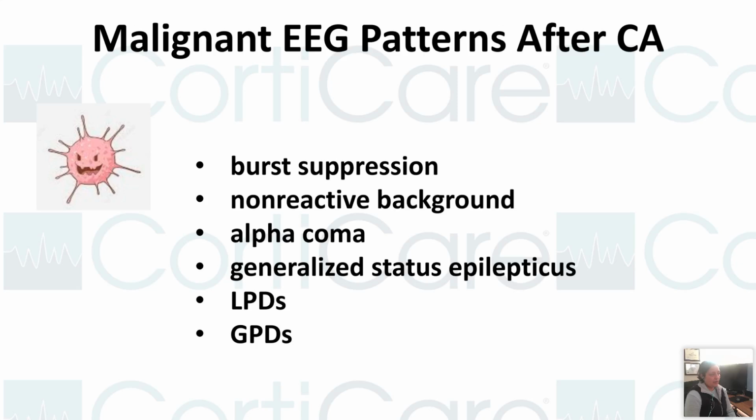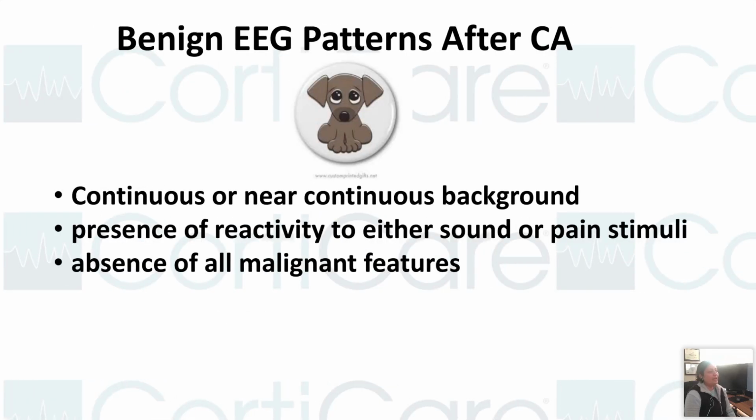A non-reactive background, of course, is not a good sign. Alpha coma or spindle coma, generalized status epilepticus, and periodic discharges, whether lateralized or generalized. And the benign patterns after cardiac arrest.